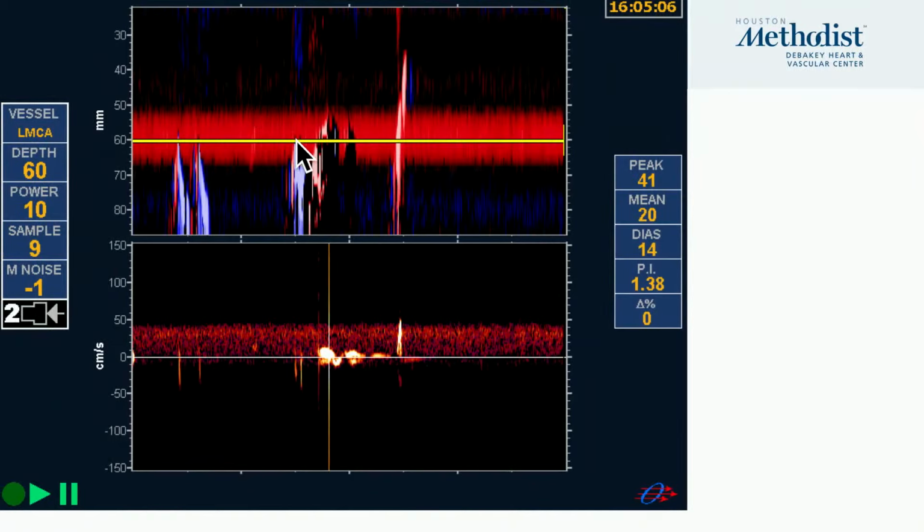Sometimes you have crazy signatures, and this is where you can see a swirly, almost turbulent signature. It goes up and down, up and down, up and down. This must be one embolus, but it's just going in circles and having a problem getting more distal, but definitely is getting into the perforators, or did not travel all the way to the terminal part of the MCA.